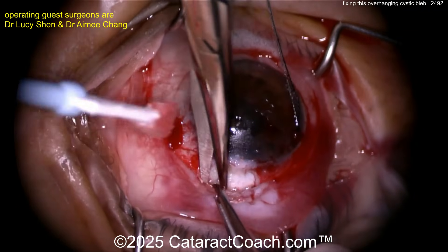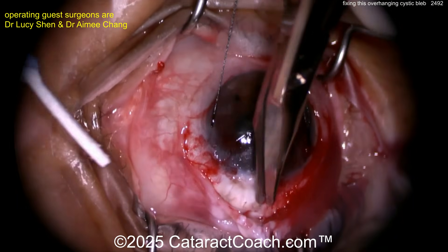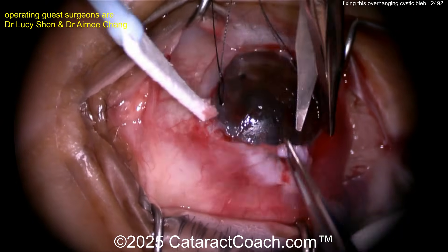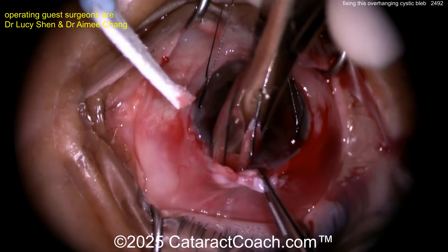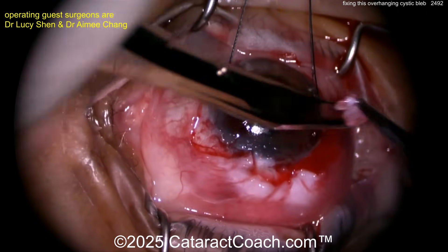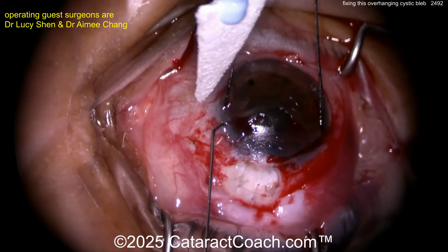Remember the ring of steel — that encapsulation. Careful dissection here, taking your time, doing more conjunctival freeing. Remove that thin cystic portion — you can see grabbing it with forceps, the thin cystic portion just kind of falling apart. There it is — that thin cystic portion is gone. Get rid of it; it's of no value here.